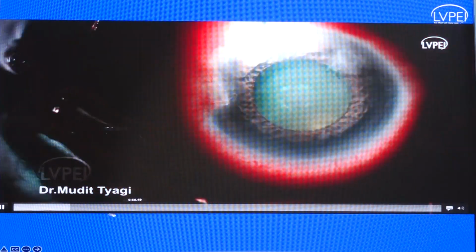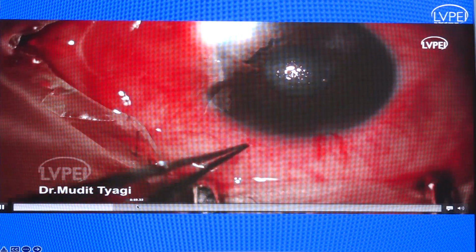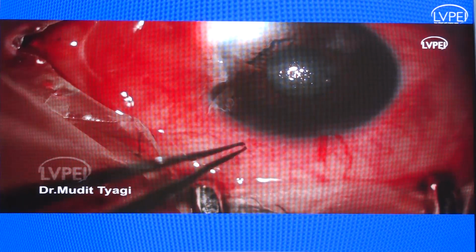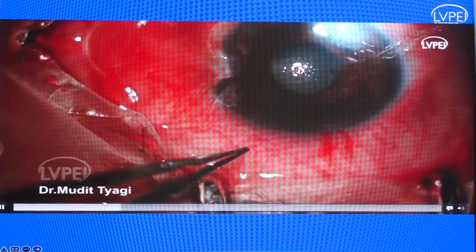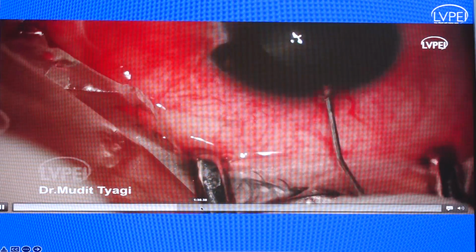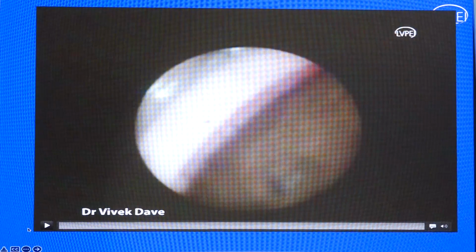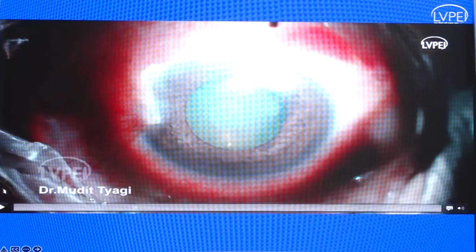And if you can see over here, what we did was that instead of going ahead and trying to remove it superficially, because the stinger was embedded deep into the stroma. So I'll just show you what we did in this case for the interest of time. What we did was we went inside with an endoscope to visualize what is happening. And I think we've come to the previous slide. Just a second, please.